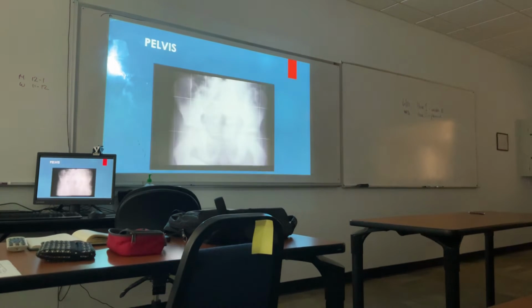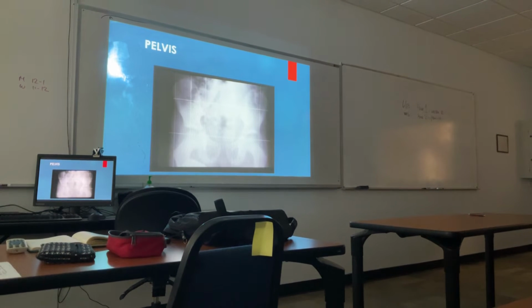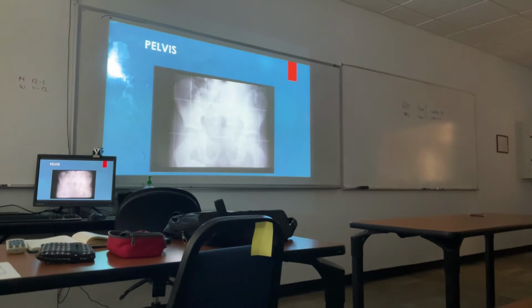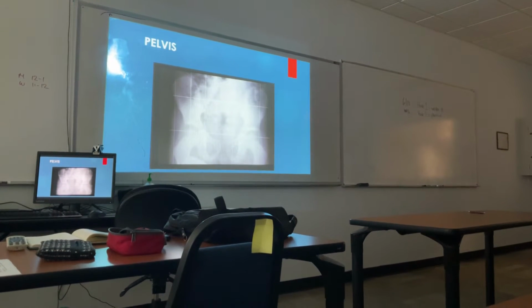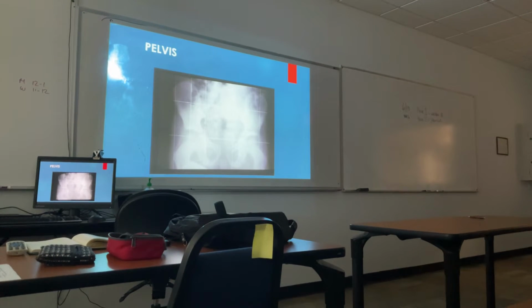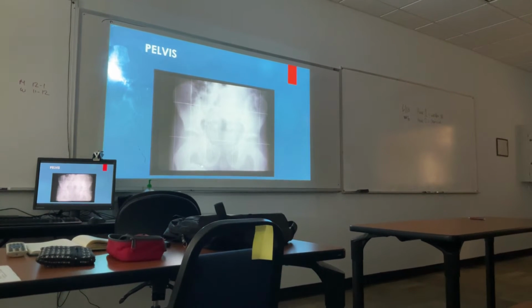Pelvis, where does the central ray go, just to make sure? Up above the iliac crest. Above the iliac crest, no, at the iliac crest. For the pelvis, the central ray, the top of the light goes to the top of the iliac crest, okay? What is this?